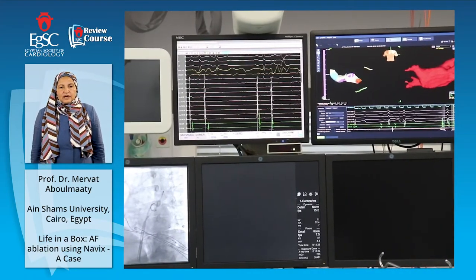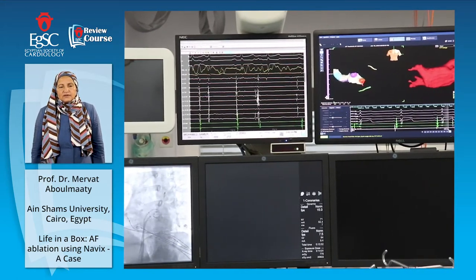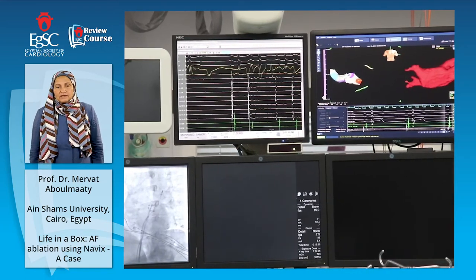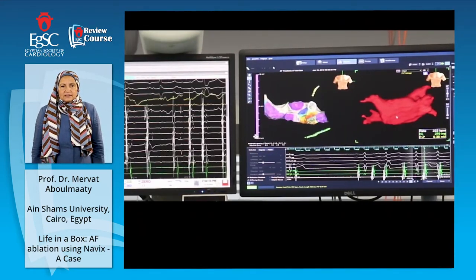In this machine, you can use the Navix. You can do mapping with the circular catheter, and you can do mapping with the ablation catheter. Using the circular catheter is easier because it collects about 20 poles, more signals, easier mapping. Now you can see this is the roving catheter.